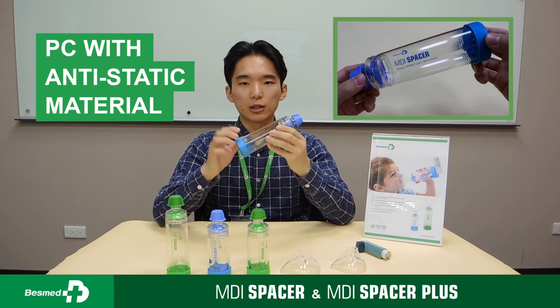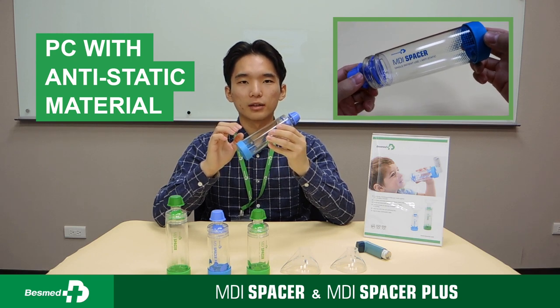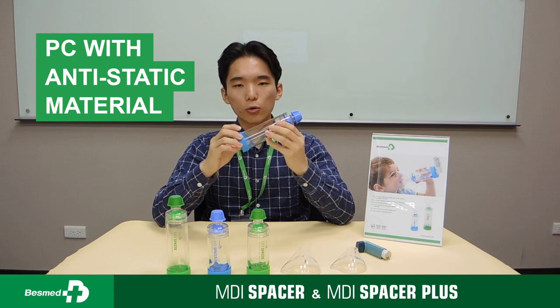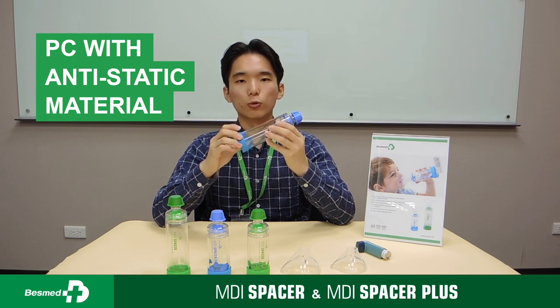There are five features that I want to share with you. Number one: the chamber is made of shatter-proof polycarbonate with anti-static material. This keeps drug residual low and makes the chamber durable for washing.